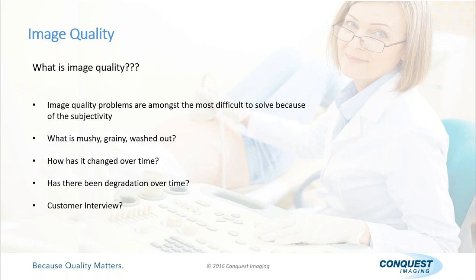One of the ways you can do that is by having these captured images, and you keep them with the machine if you can. There's no sense in taking pictures on your phone unless you're the only one that's going to work on the system, right? So you take pictures and leave. 3 months later, somebody else goes in to evaluate the problem. They have nothing. So it's really best if you can send them to PACS, or print them out from a reading station by PACS, and then leave them with the system. So there are tools out there that we can use.